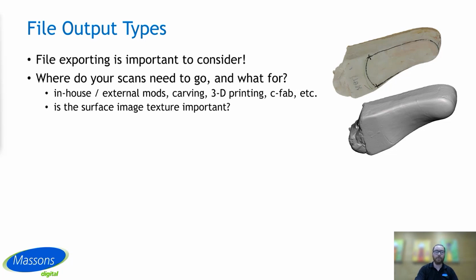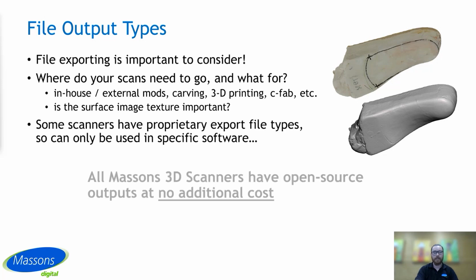Is the surface texture important? So the two examples we have here, one of them has the surface texture captured as an image and the other doesn't. It might not be important for your work. Some providers might actually require it. So it's important to know based on what you're doing with it, either what you need to use it for or what the next person down the line you're handing it to needs.